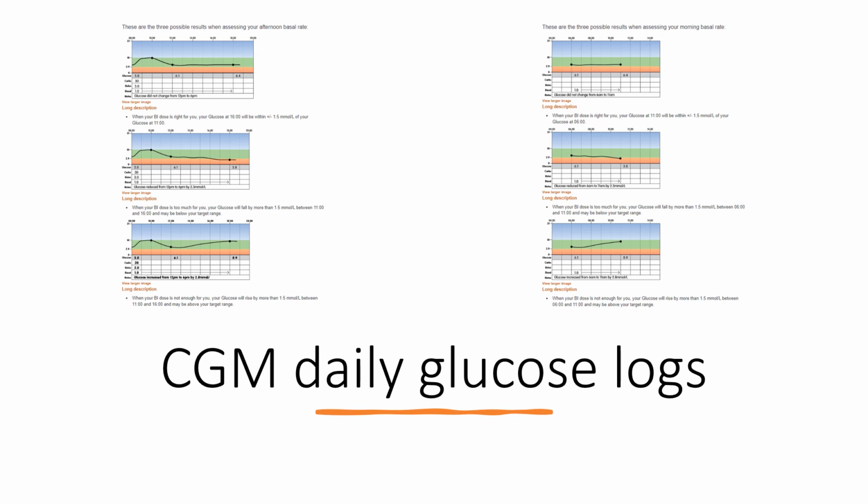Information and examples are included in Week 1 on basal rate checking in the morning and afternoon time blocks, including both diary and CGM illustrations. CGM illustrations are generic as we don't align to a single device.